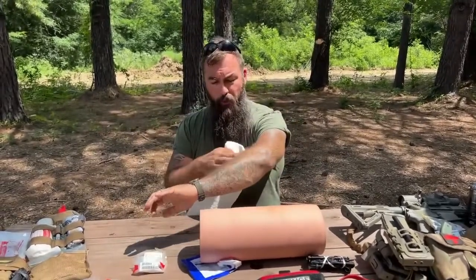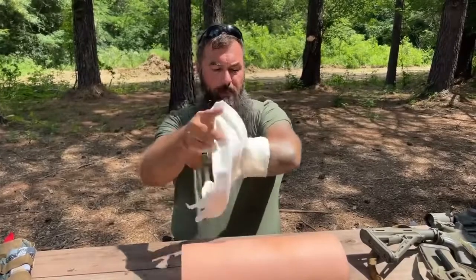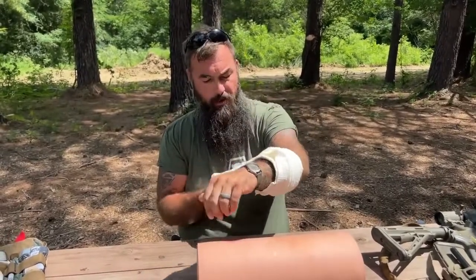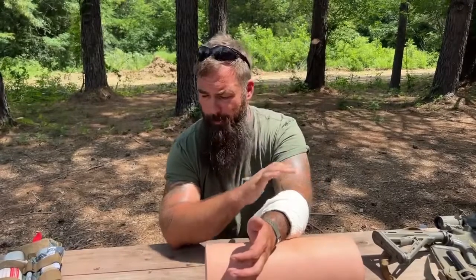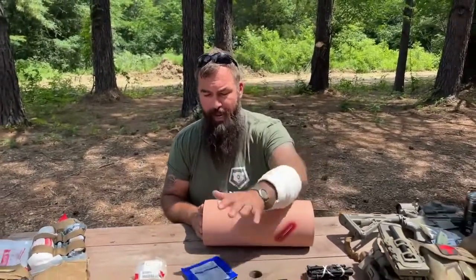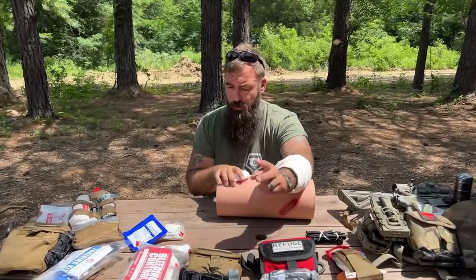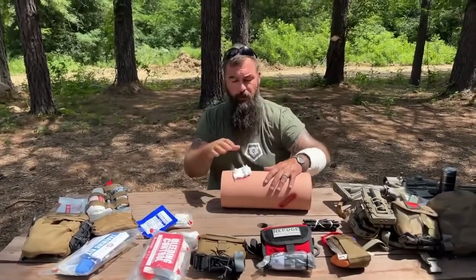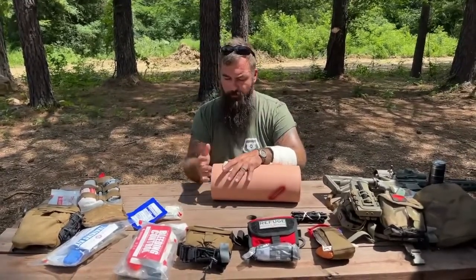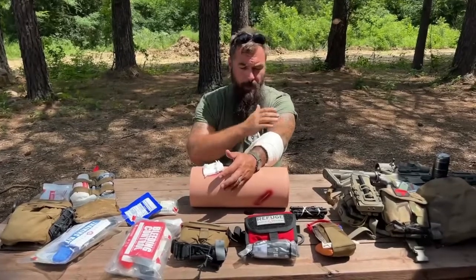You can also use pressure bandages for non-critical but bad wounds — simply wrap that wound up and apply as much pressure as needed. If it's a bad wound, apply a lot of pressure. If it's not so bad and you just need to hold the dressing in place, apply less. Like I said, this is just a big ACE bandage with a big piece of gauze on it, but they're absolute must-haves in a trauma medicine kit. In the extremities we'll use tourniquets; in our junctional areas we use pressure bandages and wound packing to pinch that bleeding vessel off. If you're out of tourniquets, you can wound pack and use pressure bandages as a secondary course of action on an extremity.